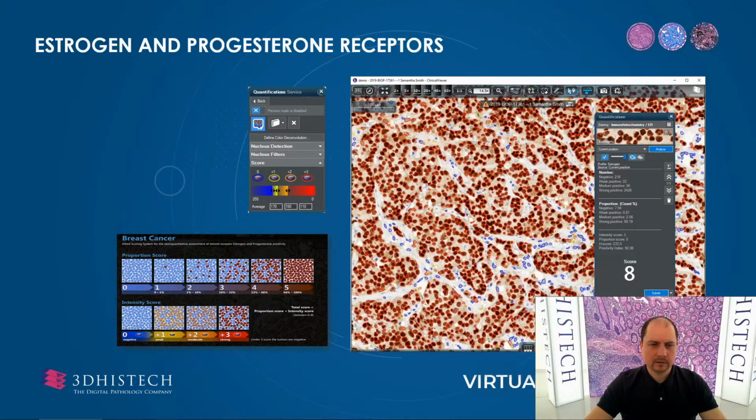These scoring clusters are adjustable for the lab processes. That is why settings mode is introduced into our system, and the top left image shows how this classification can be fine-tuned.